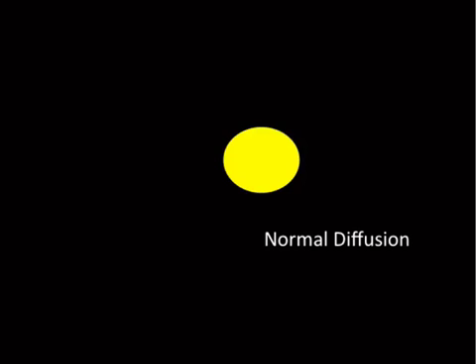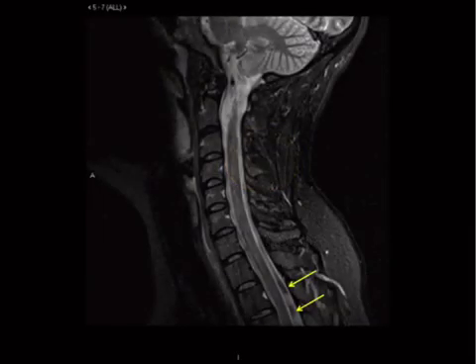So we're talking about changes that are happening really fast, okay? So this is why you're not seeing moving blood, restrict diffusion, those kinds of things. Instead, it's sort of at the microscopic level that you're seeing these little changes. But it's the same general idea of this thing that's moving out of the way, causing a void in signal. And that's why you get flow voids.